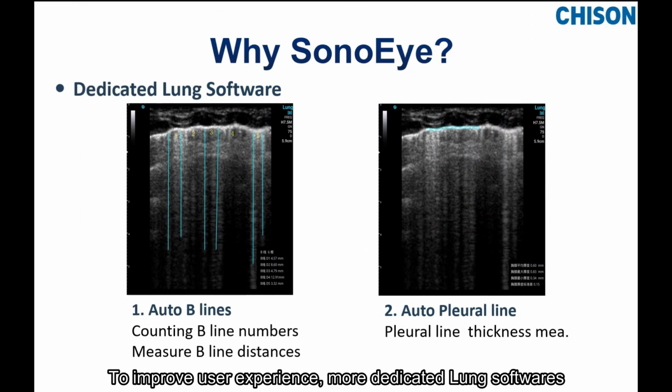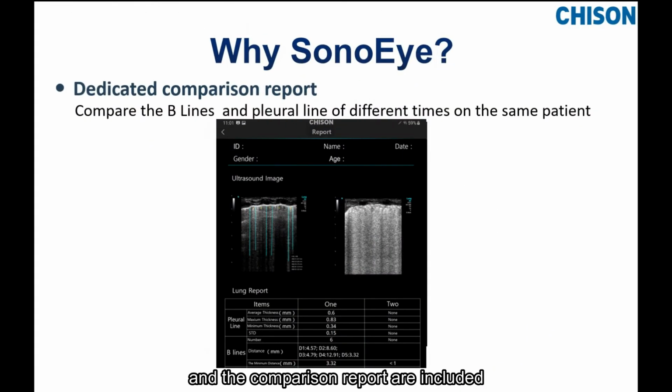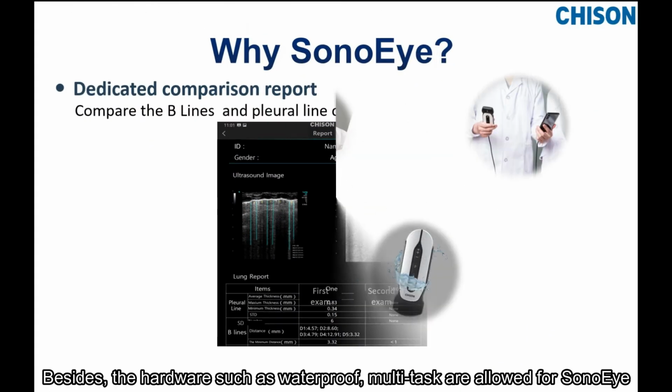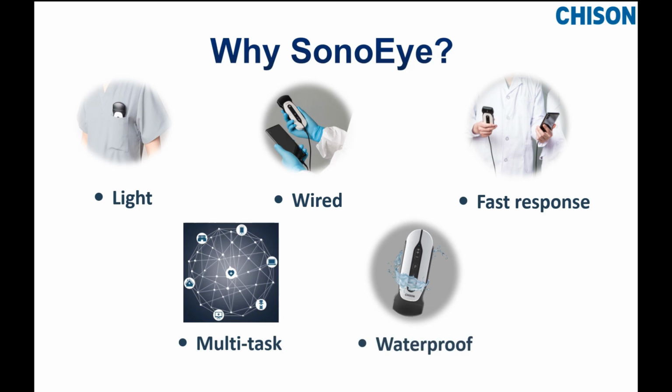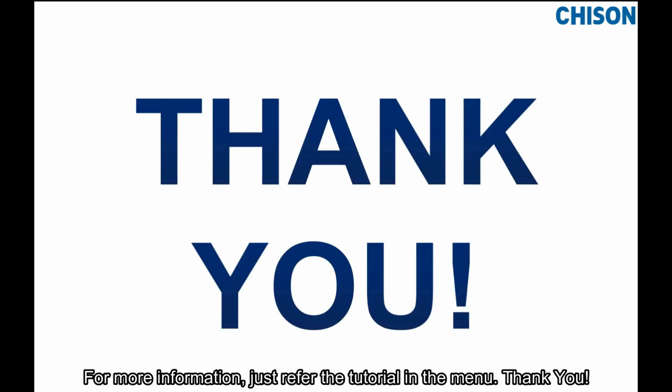To improve user experience, more dedicated lung software and the comparison report are included. Besides, hardware features such as waterproof and multitasking are available for SonoEye. For more information, just refer to the tutorial in the menu.